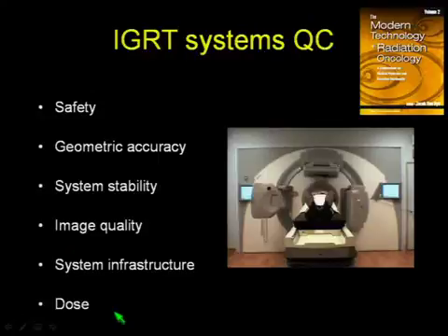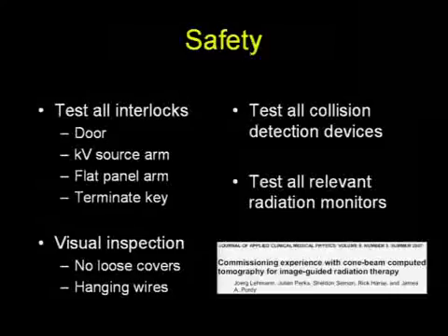Okay? In the interest of time in this workshop, we will only have time to look at safety, geometric accuracy, and image quality. And this paradigm has been described in a book chapter that I co-wrote in Jake Van Dyk's book, The Modern Technology of Radiation Oncology. So let's start with safety.